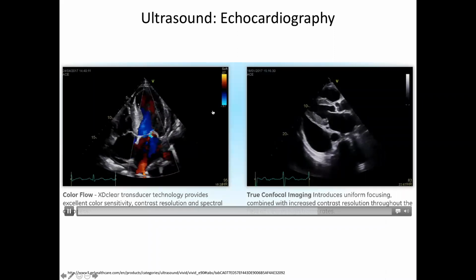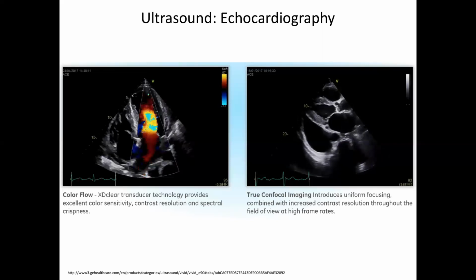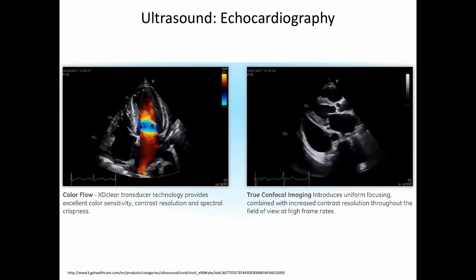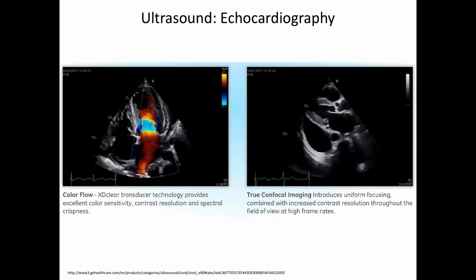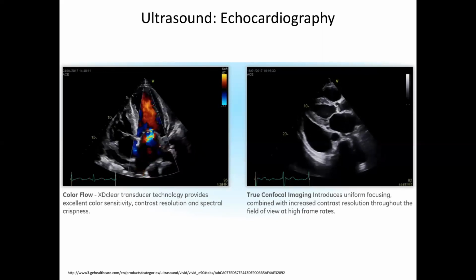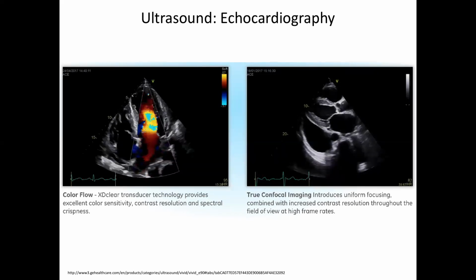All right, so this is what ultrasound is really all about, the fact you can do this dynamically in real time, watch it happen on the screen with the patient at their bedside. So somebody comes into the ER and they're lying in a bed and they're in big trouble and you don't know what's going on. You roll one of these machines up, they come with 4 wheels and you plug them into the wall, or run it off the battery, and you just roll it up to the bedside and in 30 seconds, you're looking at something like this. And so it's tremendously powerful that way.